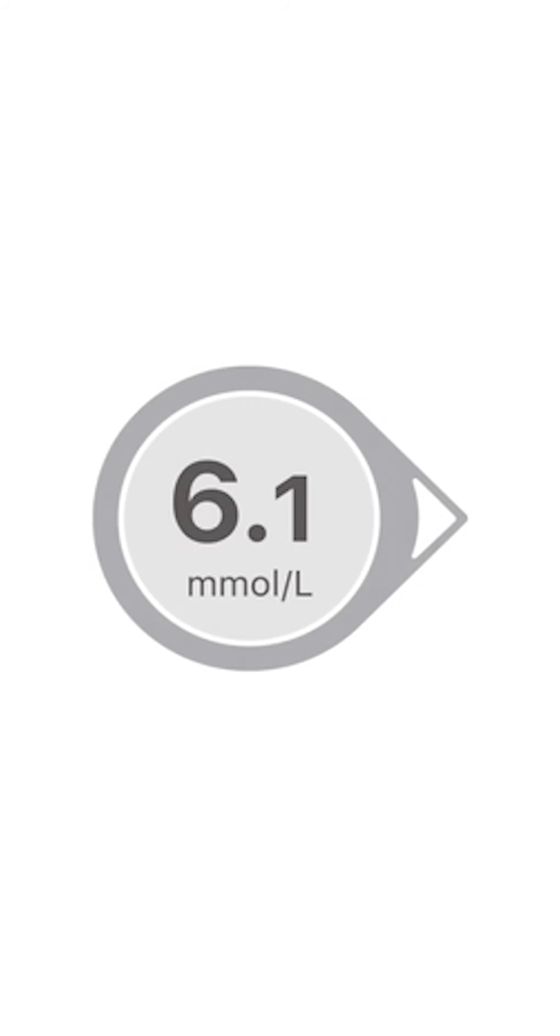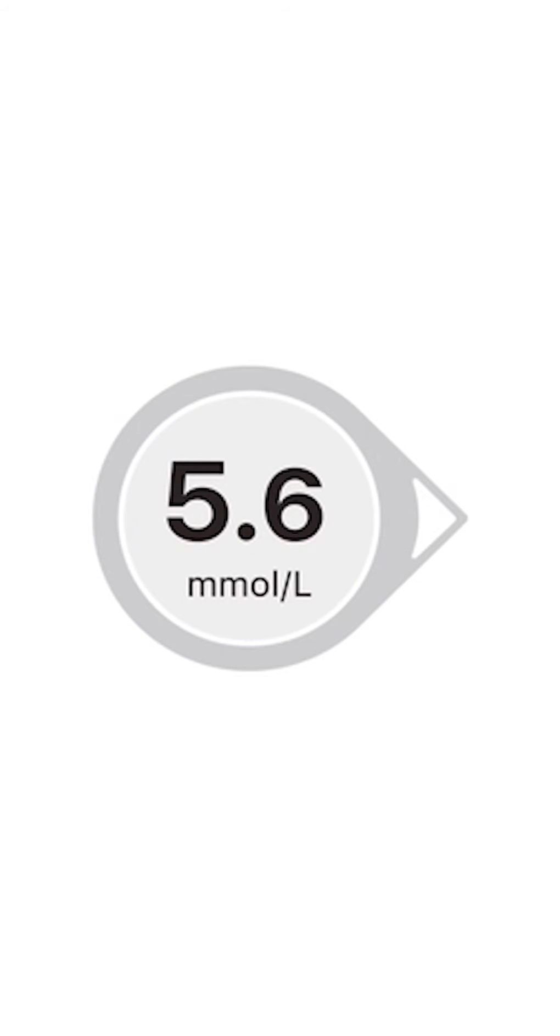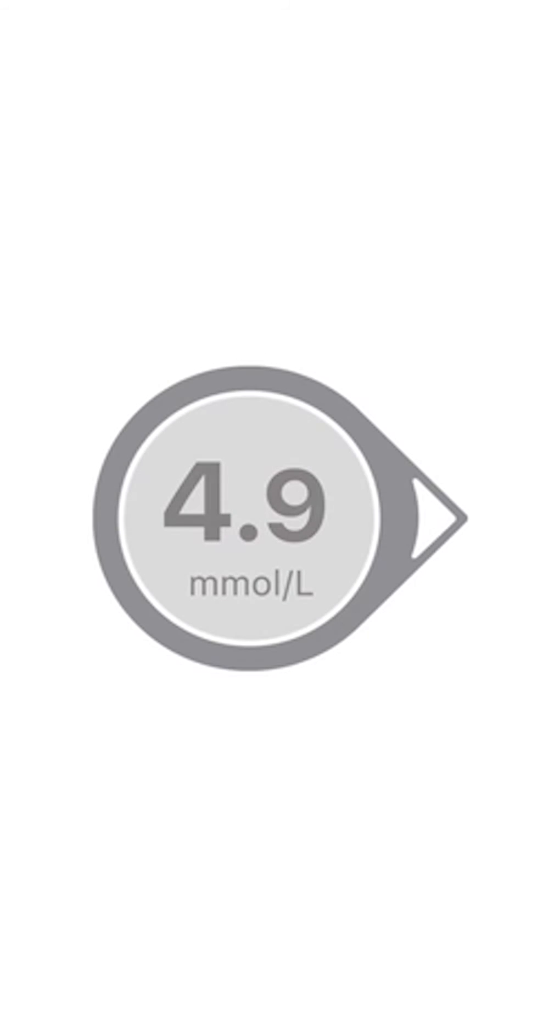The G6 shows your number and trend arrows. Your number is where your glucose is now, updated every five minutes. Your arrow shows where your glucose is trending, based on your last few G6 sensor glucose readings, or G6 readings.